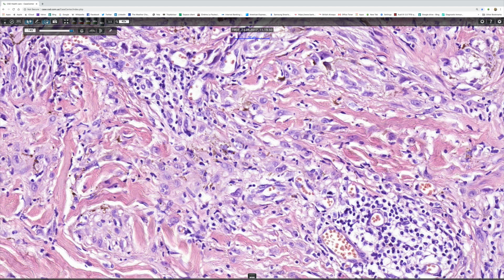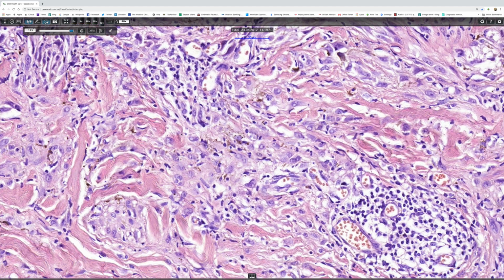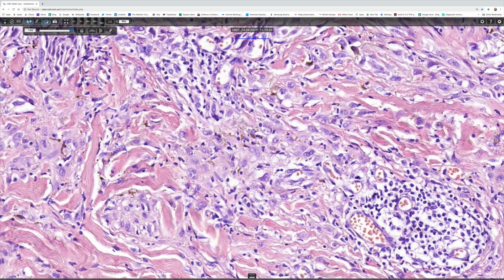And these are very typically seen in Desmoplastic Spitz nevus, and they're not of any importance other than if they're really conspicuous and you're not thinking along a Spitz nevus pathway. Let's say your mind has gone off in some other direction, you might be wondering about a signet ring cell carcinoma or something of that nature.